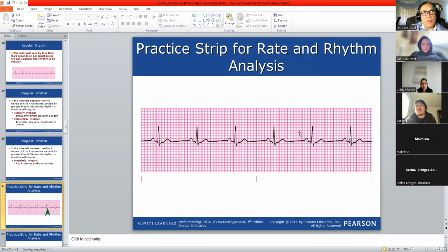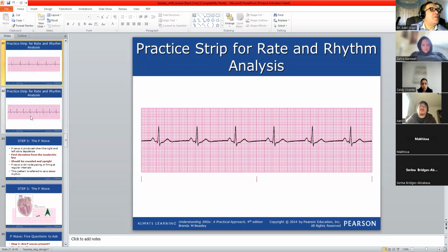So this is normal? Yes. Correct answer. Very good. And here also, what is the heart rate? 80. 1, 2, 3, 4, 5, 6, 7, 8. Okay, so 80. Very good.